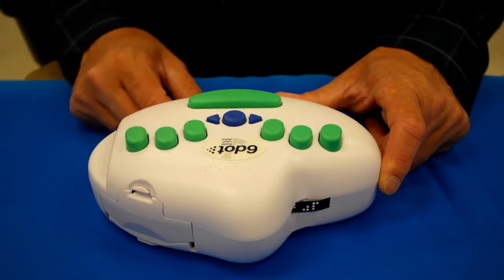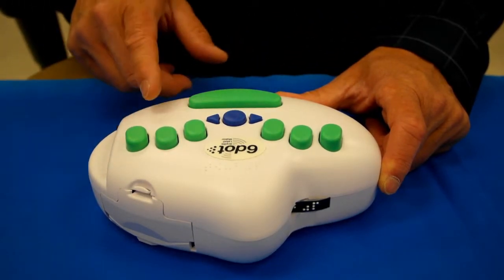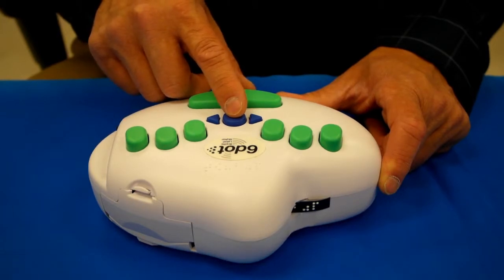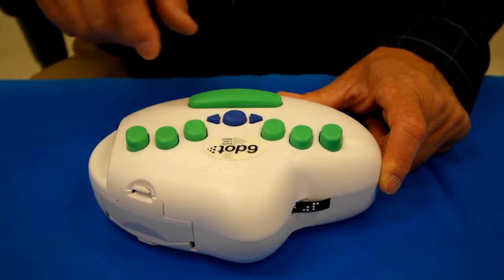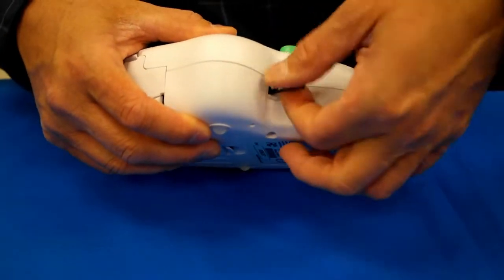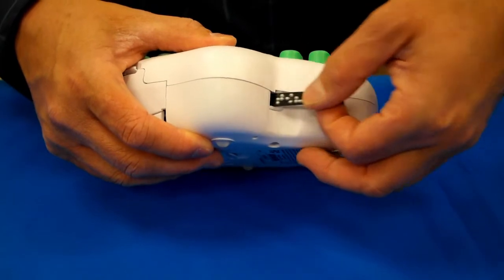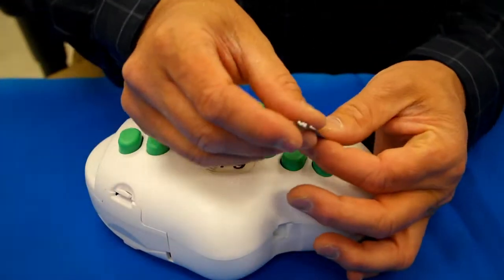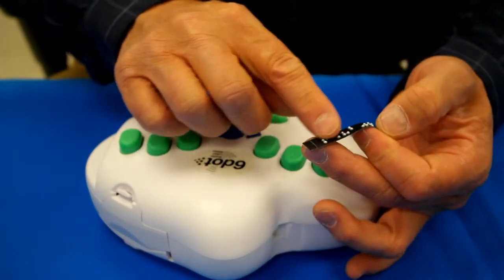You can type faster than it can print, so you'll wait for it to print, and then press the round button in the middle of the Perkins keyboard right here. It automatically cuts it. You reach over around the far left side and pick out the tape, and you can see that you can read it, and that came out really nicely.